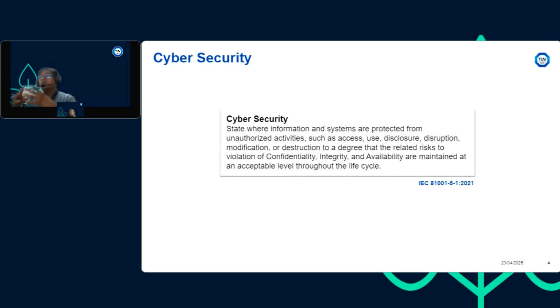Now most of you are already working in and out with cybersecurity, or more of general cybersecurity, where we are testing our perimeters, networks, and we have antivirus installed in our system. We have endpoint detections and all those systems in place. But is this really sufficient to protect against medical device? Here we need to understand one particular thing. All the typical and legacy methods of cybersecurity provide protection of these medical devices up to a certain extent only. We need to make sure we have a product-based assessment for that medical device to make sure things are going in the right direction. We can protect our data, we can protect our people's lives with these particular incidences.